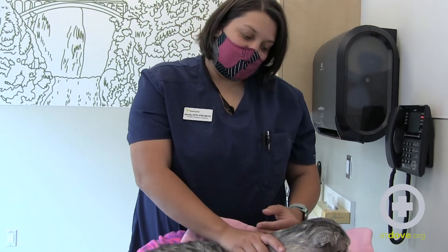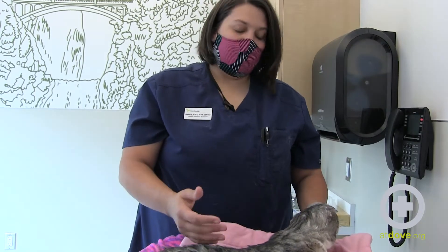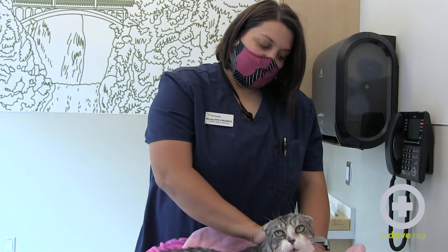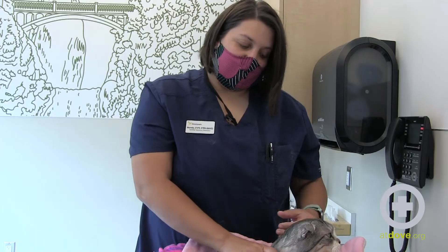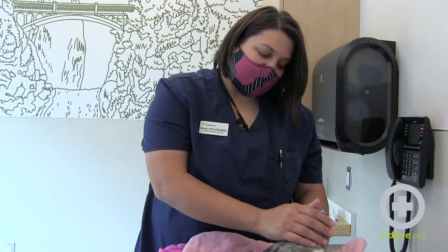A really good benefit for cats is if they can be in their favorite bed, maybe by a window with a bird feeder. If they're relaxed they're going to do much better. Some cats can get really stressed by this, and if you feel unsafe doing it make sure you have a second person to help you or get further instruction from your veterinarian on how to personalize the care that they need. And that's how you give an insulin injection in a kitty cat.